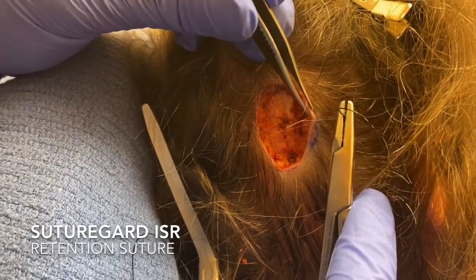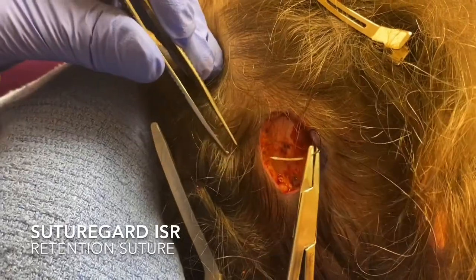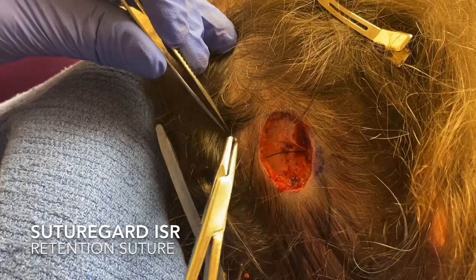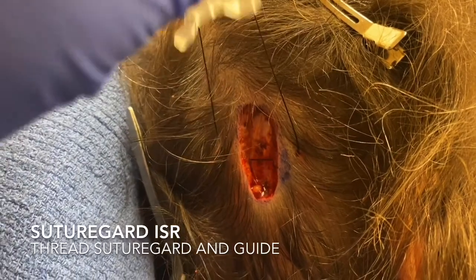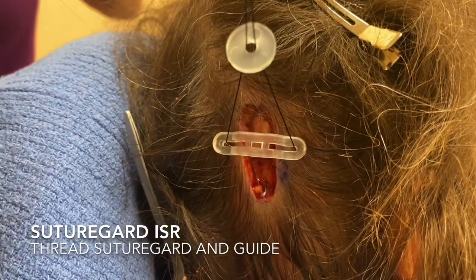This is video of intraoperative skin relaxation using the SutureGuard device. First, I'll use a zero nylon retention suture — this is our custom suture that SutureGuard sells — with a large bite, about 10 millimeters or so. I'll cut off the needle and then thread the device and the guide onto the suture.